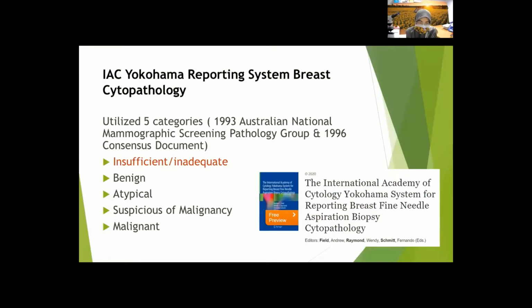So they are also utilizing the same 5 categories, based on the same coding system, with a little bit of change to the criteria for insufficient or inadequate. But for the rest of the criteria for benign, atypical, suspicious of malignancy and malignant, they did provide guidance or guidelines in order to standardize the reporting pattern and to help and guide pathologists in cases where any ambiguous cytology features are present.